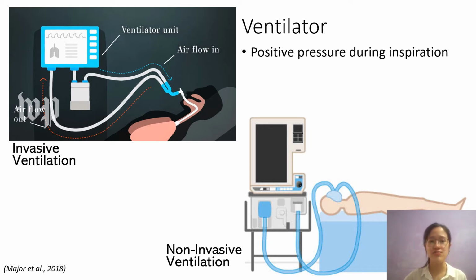So the interaction between the patient and ventilator becomes important. Depends on the patient condition, different types of ventilation strategies will be selected. Besides having an invasive or non-invasive type of ventilation, it can be controlled by different parameters.